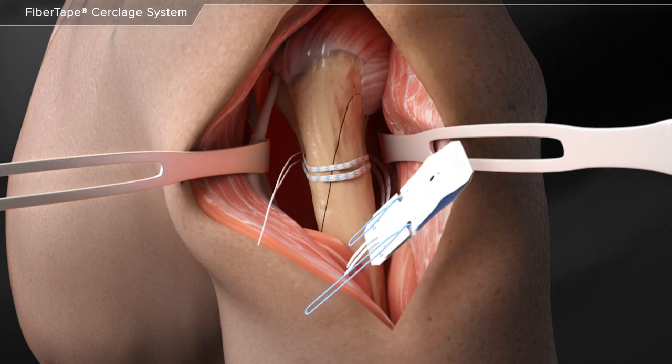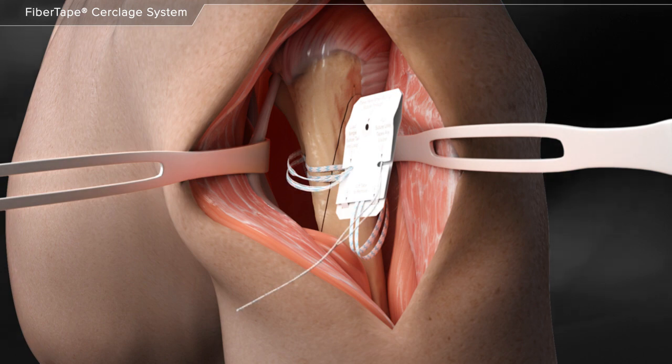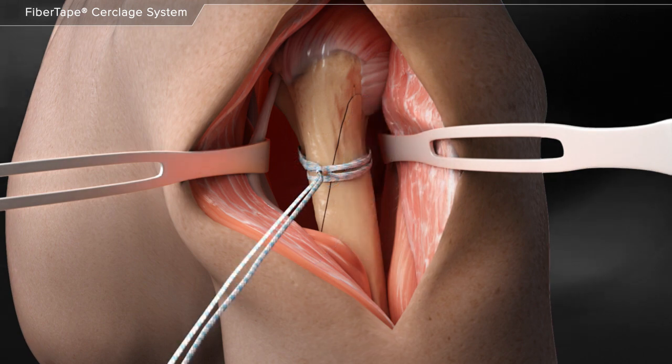Once the FiberTape cerclage suture is passed, the suture tail is loaded through the pre-tied racking hitch knot. A card is included to help facilitate the loading of the suture. The single tail is loaded into the loop and is then pulled through the card. Once the tape portion engages the knot, the card can be discarded. The suture should then be hand-tightened around the bone.